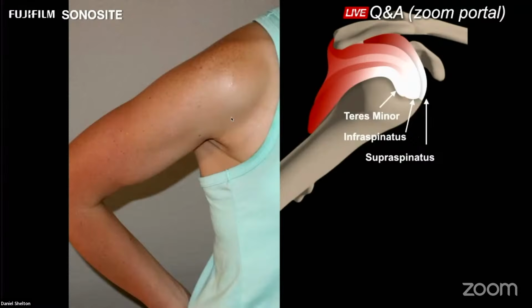If your patient's not able to do that, it's okay. Start in a fairly neutral position, with the arm slightly internally rotated, and pull the elbow back, maybe to the outside of their thigh, and just see what kind of range of motion you can get away with. But look at the stretching that's occurred on the supraspinatus anteriorly. The infraspinatus follows as it overlaps the supraspinatus by a third. Teres minor follows much more inferiorly, and we'll talk about those, especially in the live scan.